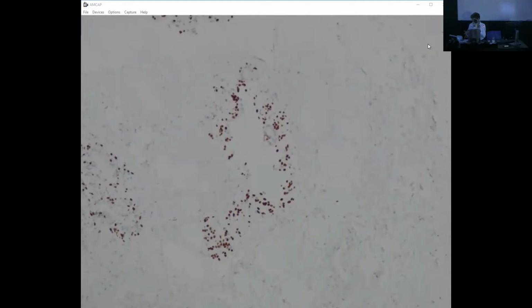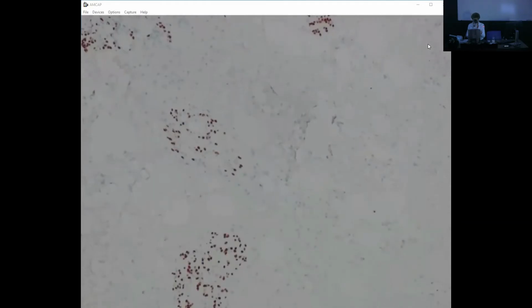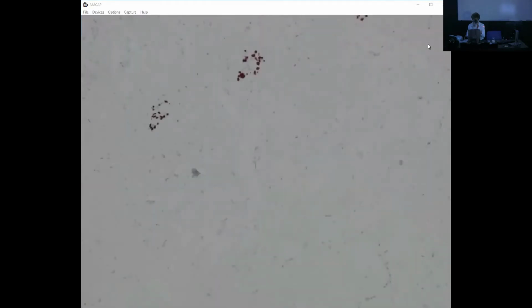I don't know if this patient had been treated. I don't think so. That doesn't say. She had not been treated yet. But there is a lot of myoepithelial hyperplasia. Could pick up. Excellent description. Thank you. They have a sort of floral aspect.